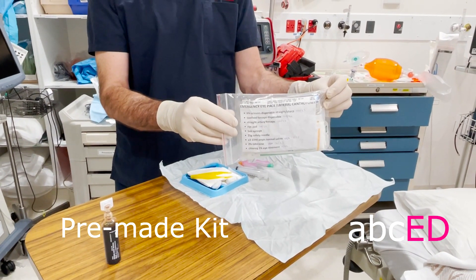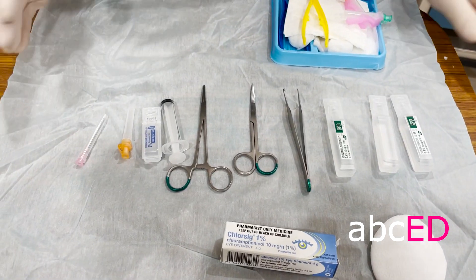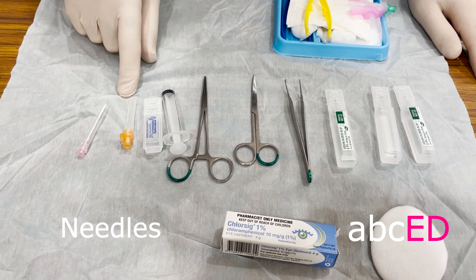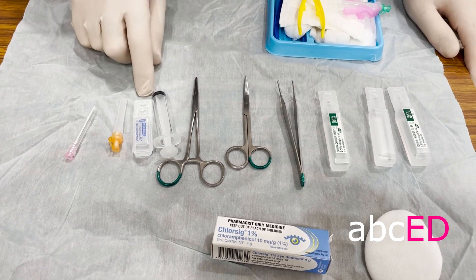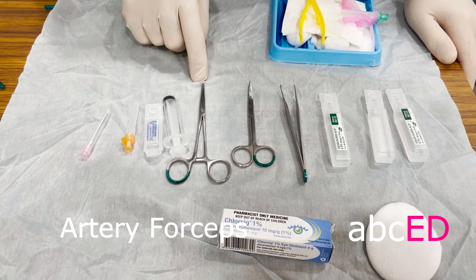We use a special purpose-built kit just to save time — it's got everything you need. This is our kit: drawing-up needle, needle to put the local anaesthetic in. We're using 2% lidocaine, 5ml syringe, and artery forceps.